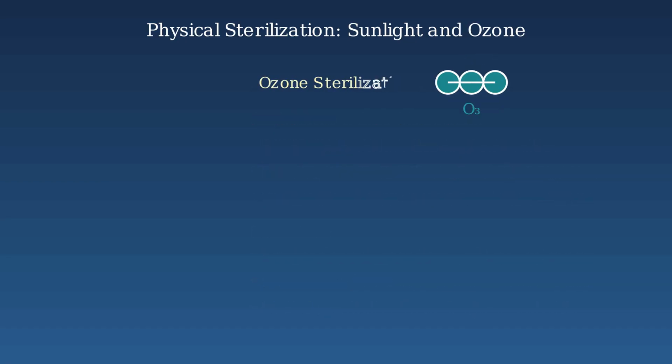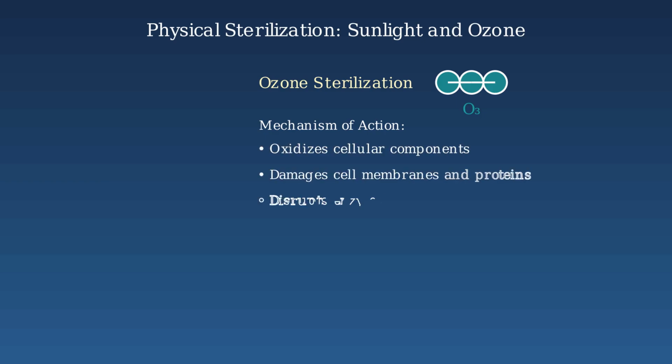Ozone, a triatomic oxygen molecule with the formula O3, is a powerful oxidizing agent used for sterilization. Ozone's sterilizing effect comes from its ability to oxidize cellular components. It damages cell membranes and proteins, disrupts enzymatic systems, and breaks down nucleic acids, ultimately leading to microbial death.